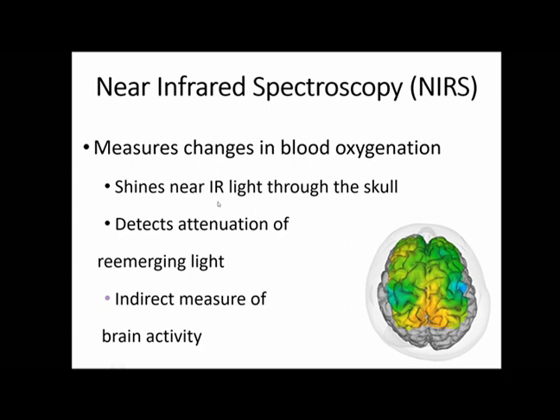But if you think of, so look at our image here. This is someone's brain from the top, so that's their nose there. So this would be the back of their head over here. And if you had your weird infrared flashlight, we'll say that's what that is, and you shine your beam of light onto the surface of the skull at just a little bit of an angle.